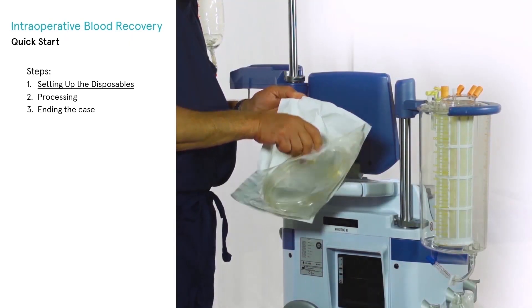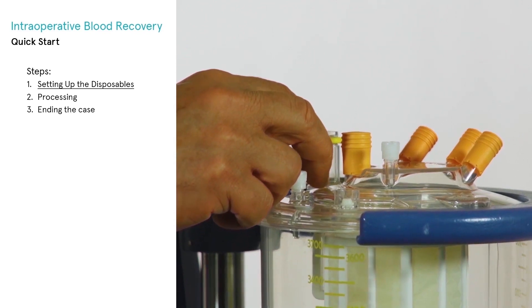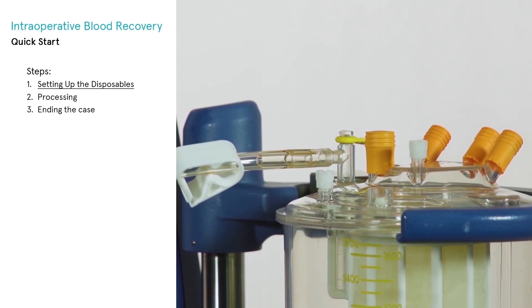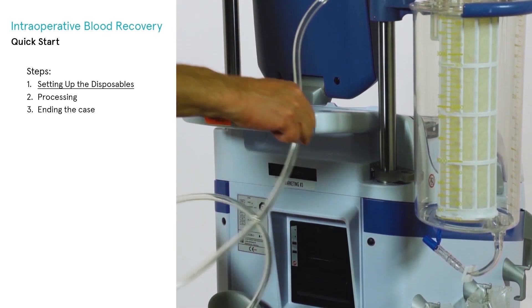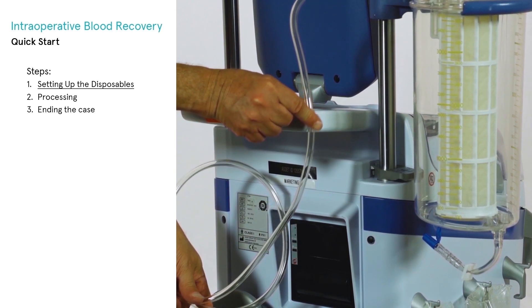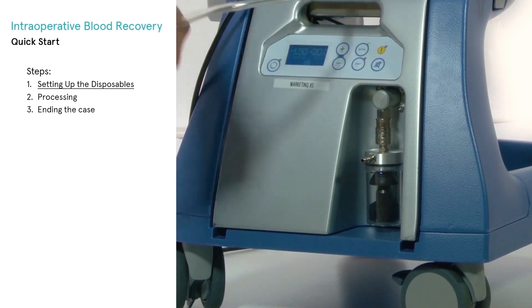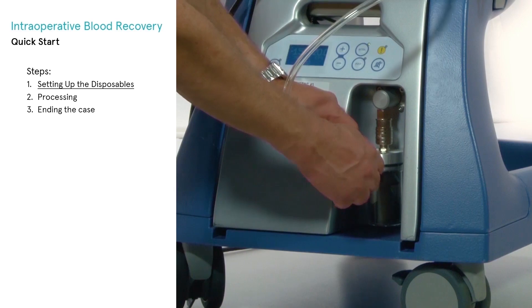Open the vacuum extension line package and, using aseptic technique, attach one of the yellow capped ends of the vacuum line to the yellow capped vacuum port on the top of the reservoir. Placing the vacuum line in the groove on the handle prevents weight from being added to the reservoir, which can interfere with the auto-start feature. Attach the other end of the line to the overflow trap of the X-VAC system.